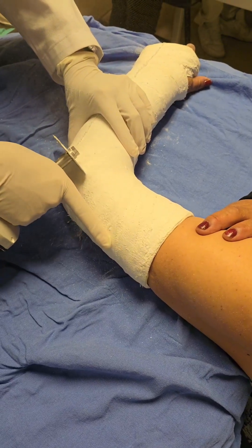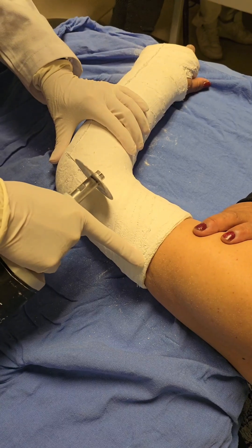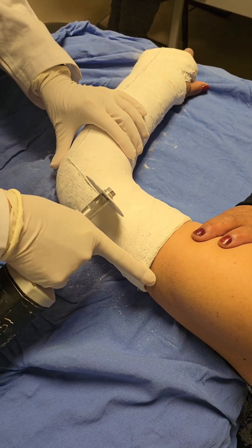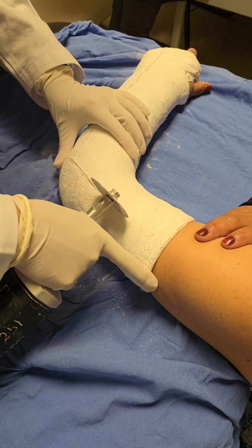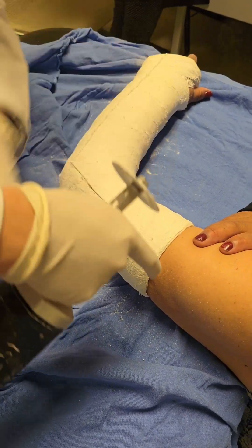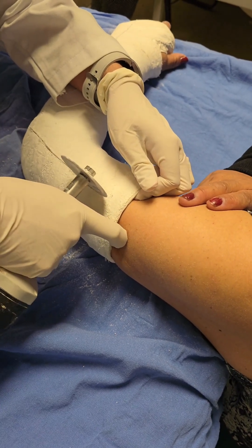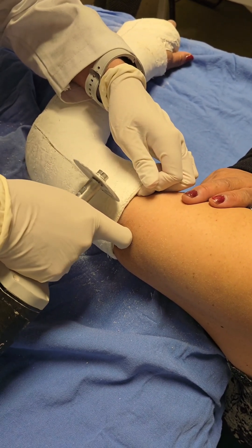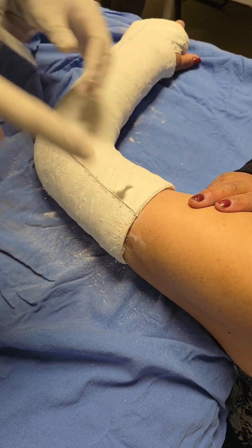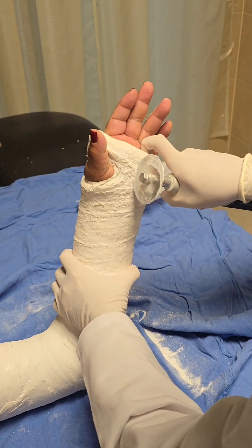Understanding the cast saw — myths versus reality. Before we jump into the actual removal, let's address some common concerns and myths about the cast saw. Myth one: oscillating motion, not rotation. The cast saw doesn't spin like a regular saw. Instead, it vibrates or oscillates. This motion is key because it allows the saw to slice through the cast without penetrating your skin. It's engineered to be safe, even though the buzzing noise can be a bit intimidating.